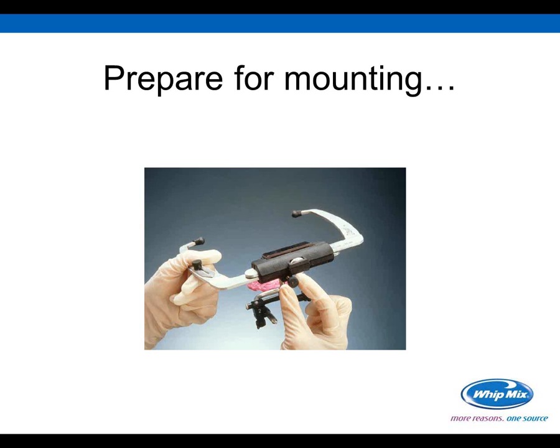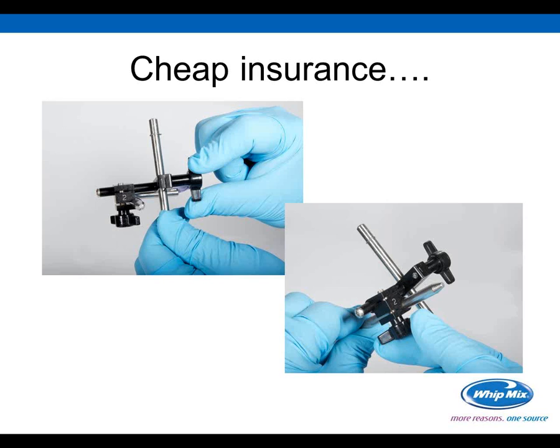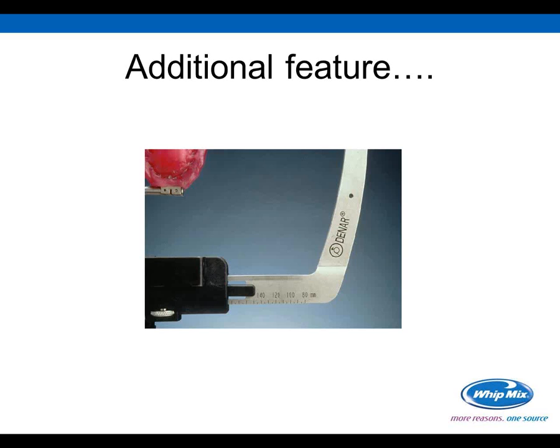The other thing I want to do before my patient leaves is tighten down my knobs. It's just some cheap insurance to make sure nothing moves. So what I'm doing here is, as I'm holding the vertical shaft, I'm tightening down my knob number 1, and then I'm going to hold and support my fork while I tighten down number 2. The reason I'm supporting these opposing areas is so that I don't modify or alter the bite registration that I just took. And you're going to be surprised at how much more you can tighten these knobs.